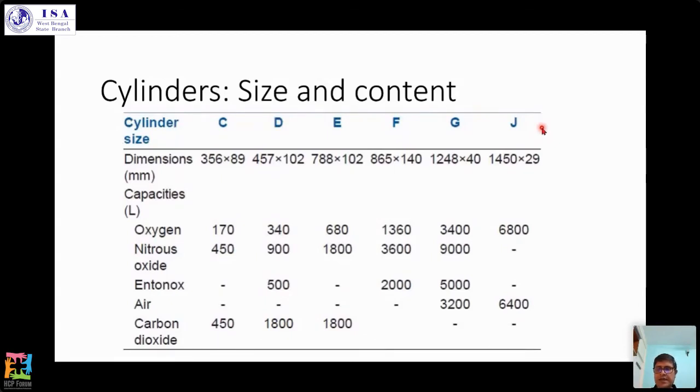But both these things have been taken over by Linde. So Linde is supplying all of the medical gases now, but the Linde India website has a paucity of information. I looked up the BOC website in UK. They have excellent information on all the cylinder sizes they supply, but there's nothing like the cylinder sizes to talk about, because the cylinders that are left are the old BOC cylinders. So these are the particulars of these old BOC cylinders.